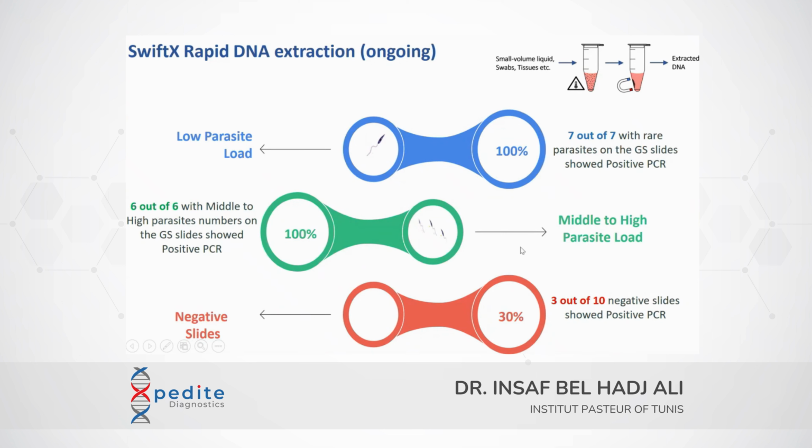And among the negative slides, we were also able to detect 3 samples that were negative with the direct examination, but were positive with PCR using the same DNA.